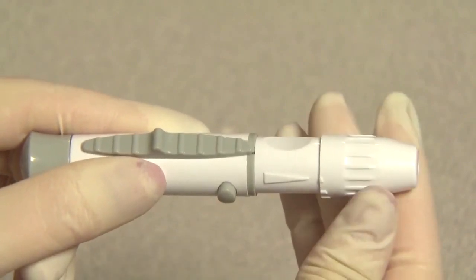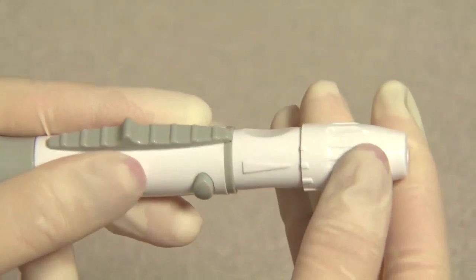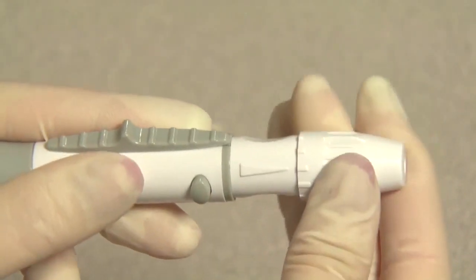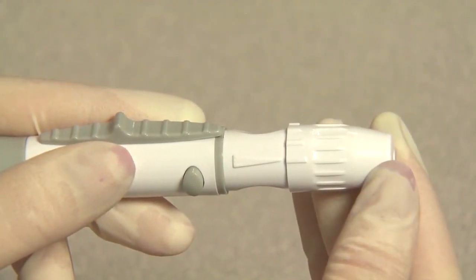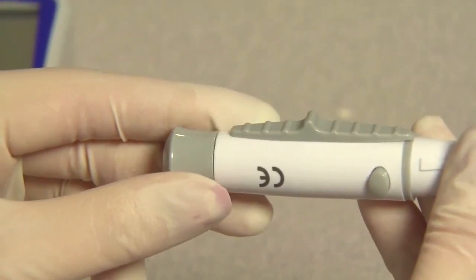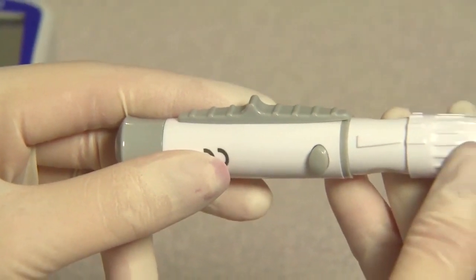To reduce discomfort, use the lowest setting that still produces an adequate drop of blood. Use settings 1 and 2 for delicate skin, 3 and 4 for normal skin, or 5 and 6 for calloused or thick skin. Pull the cocking barrel back to set the lancing device. A click may be heard. The device is now loaded and ready to obtain a drop of blood.